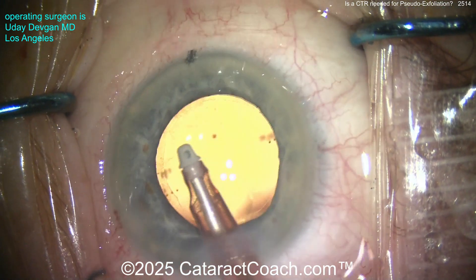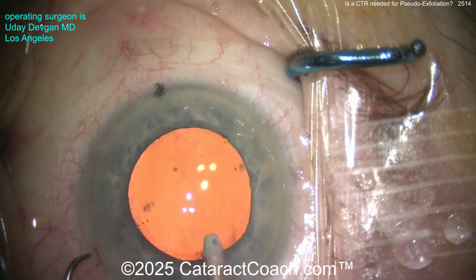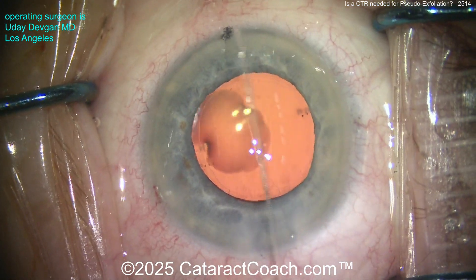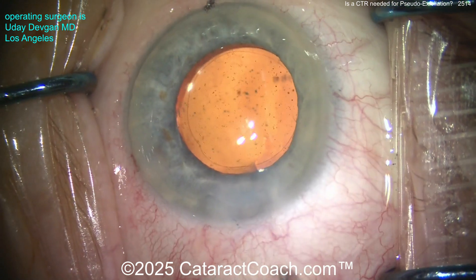You can see the toric marks on the IOL, and there are also toric marks we made on the cornea — all we have to do is line those two up. By the way, look at the rhexis size — just about perfect. It's about a 5.5 millimeter rhexis, nicely overlapping the optic for 360 degrees.